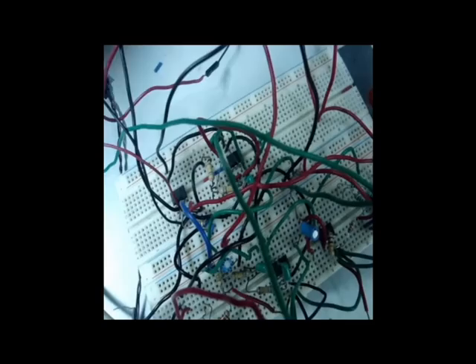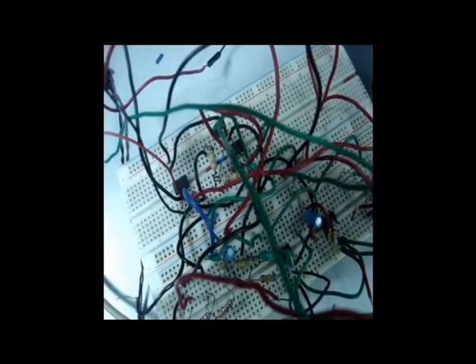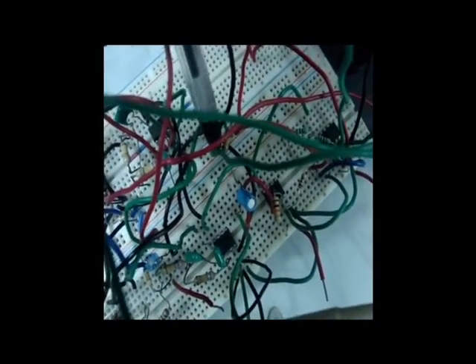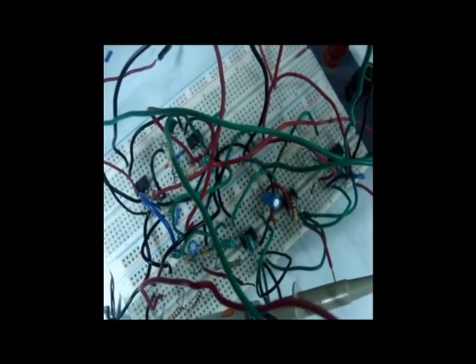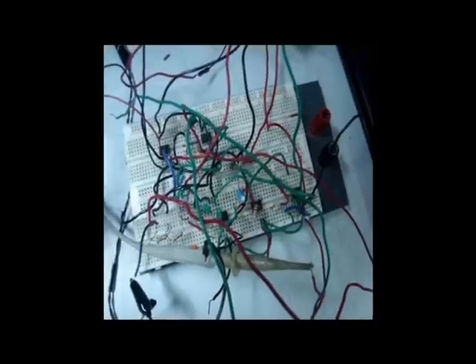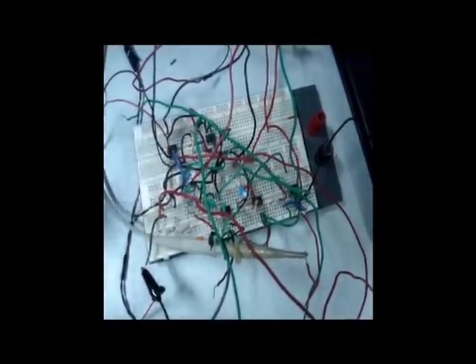In order to amplify this AC signal we have to eliminate the DC component. For that we use a simple first order RC high pass filter which eliminates the DC component. The cutoff frequency of this is 2.5 Hz. Now this band pass stage is repeated once again for further filtering the signal. The output obtained after the two-stage band pass circuit is an AC signal of amplitude around 8 to 10 millivolts.